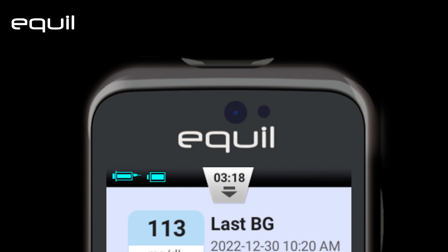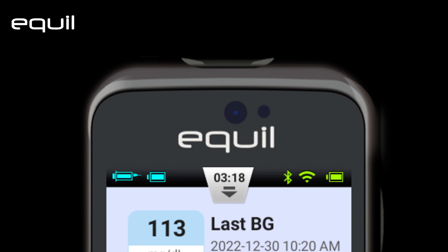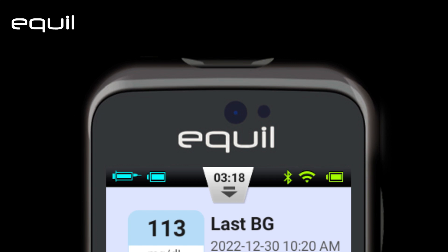The status bar is divided into two parts, separated by time. In the English version, the left part of the bar corresponds to the pump and is colored blue, and includes an icon representing the pump's battery status. It will show the charge decreasing gradually, unless the connection is lost with the PDA. There's also an icon that shows how much insulin is left in the reservoir in different degrees, and if the PDA wireless link is poor, it displays this symbol. You can see the PDA status, which is green on the right.